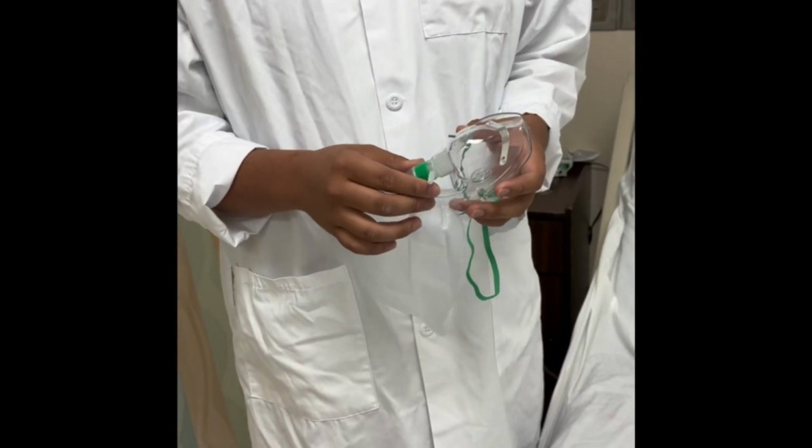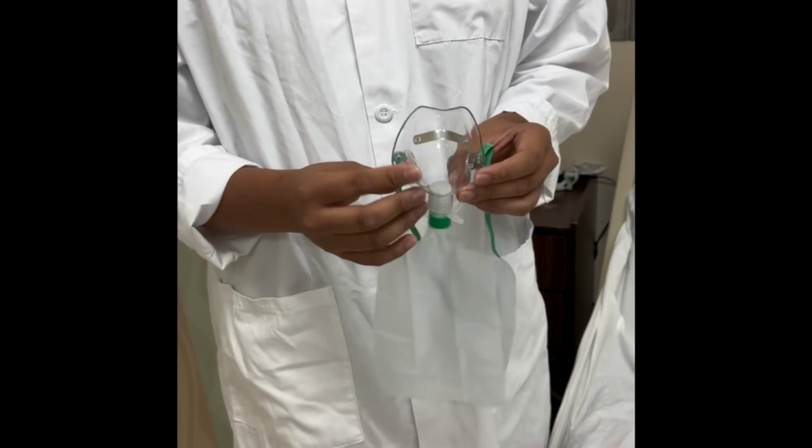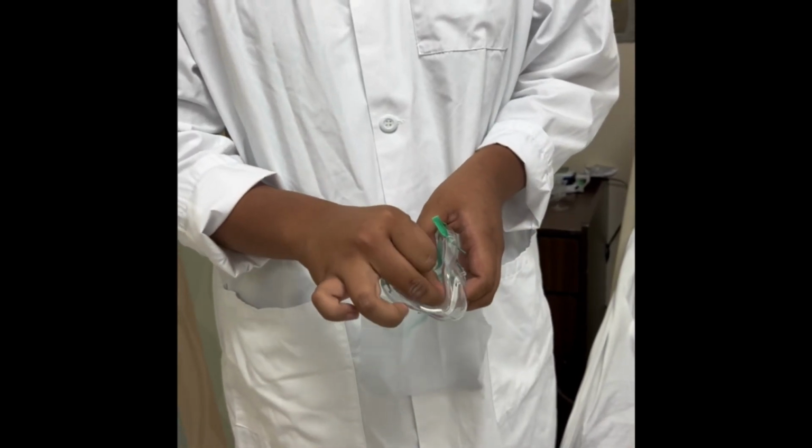Alright, we're going to be going over the equipment we use for this treatment. First, we have the non-rebreather mask. This also doubles as a partial rebreather once you take off the valves you see here.